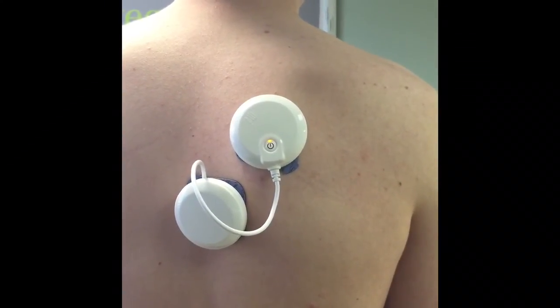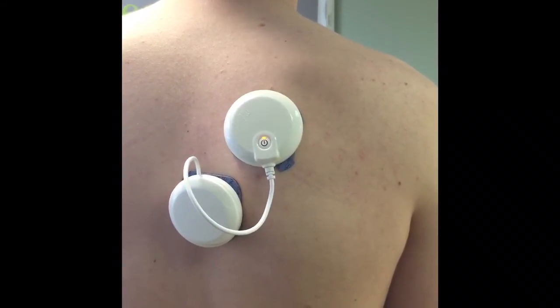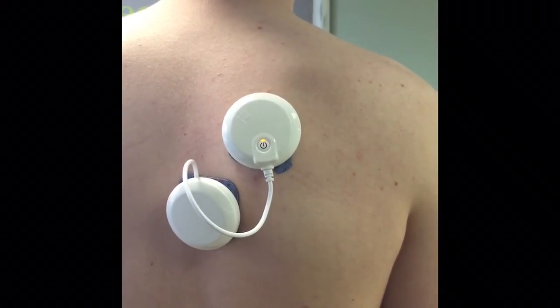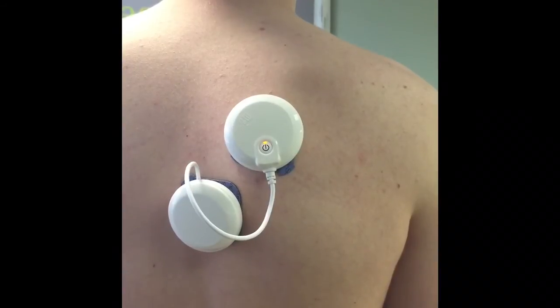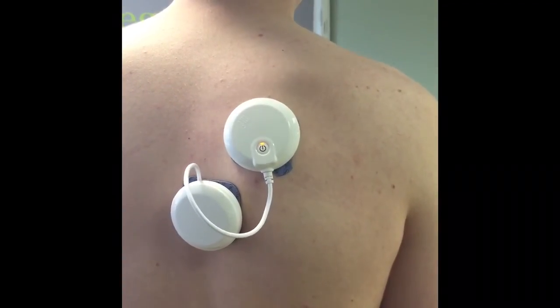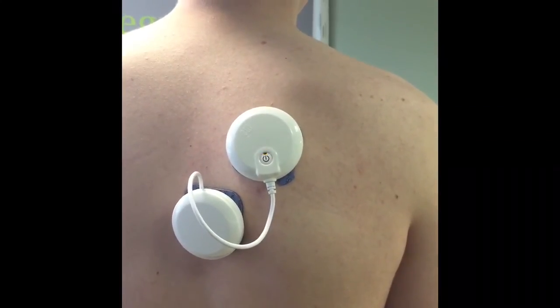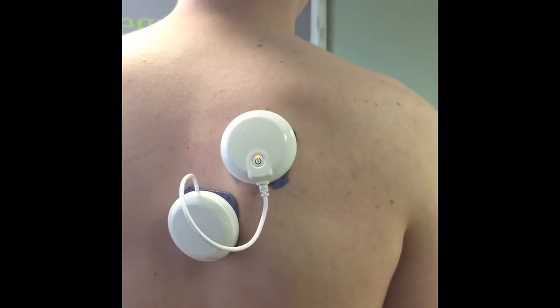So we can turn the strength of the muscle up, and you'll see it contracting and moving there, and you'll see Joe's shoulder gets pulled back into a better position. The machine then cycles between twitching the muscle and back into a contraction again.